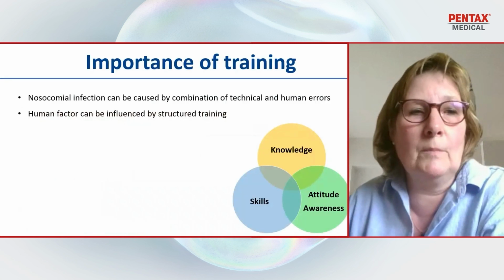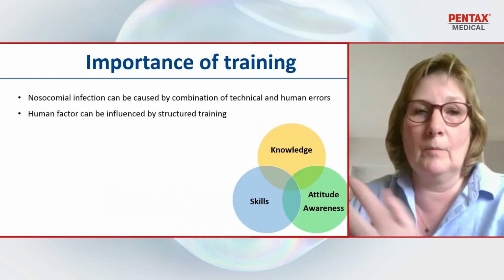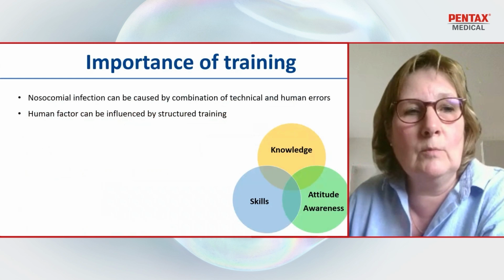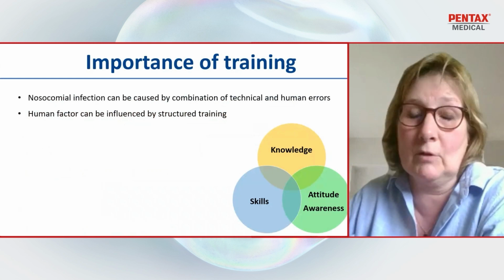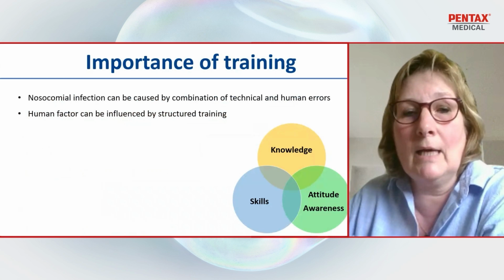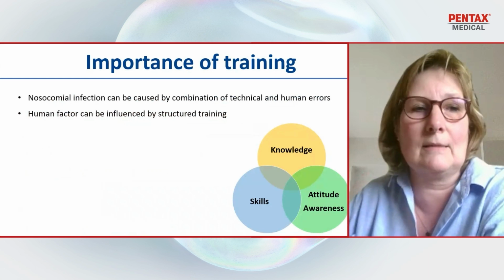So in conclusion, nosocomial infections can be caused by a combination of technical errors and human errors. And the human error can be influenced by structured training. And then we have knowledge and skills, but we also have a change of attitude and awareness.